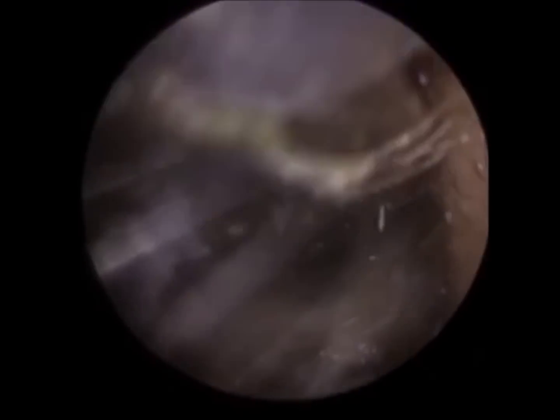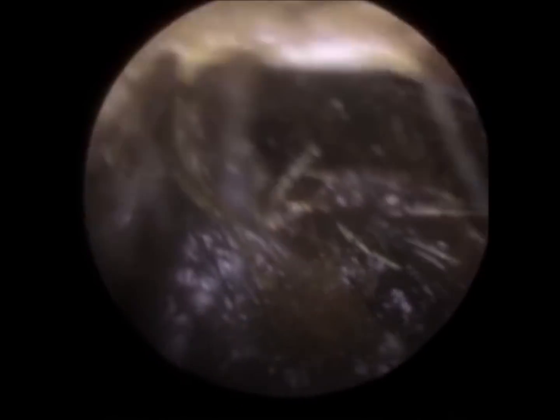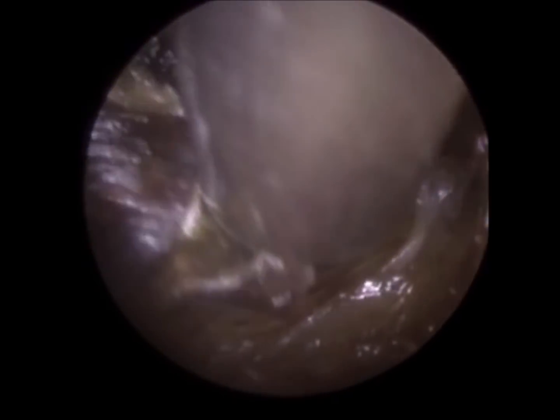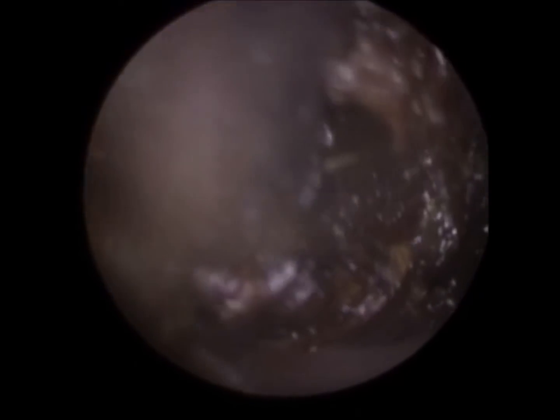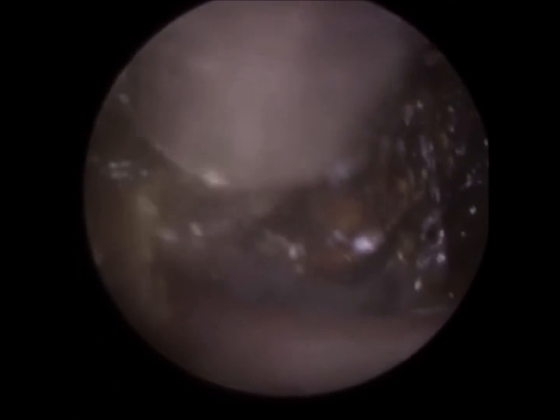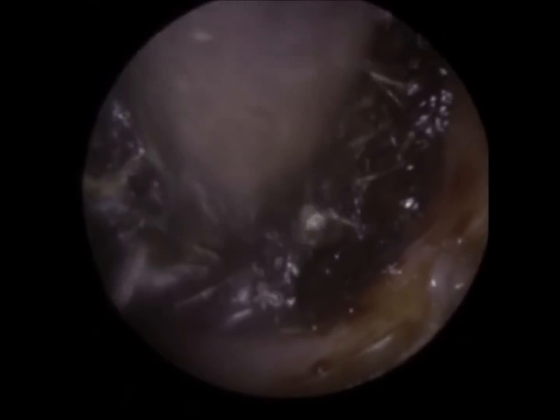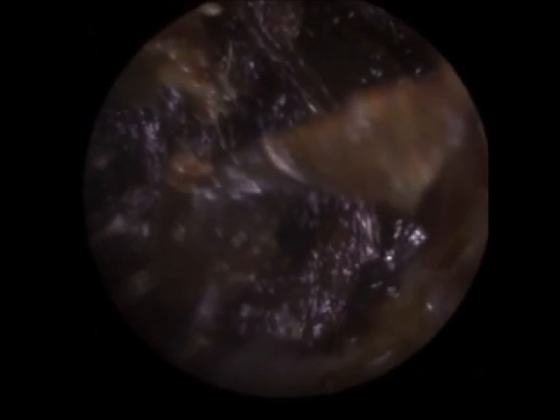But in this ear, after I moved the lateral wax, so the lateral means the wax near the entrance, the wax further in, so the more medial wax, is a lot more compressed. So I had to put some olive oil drops on a couple of occasions, just to loosen it, lubricate it, in order for me to remove. Again, I'm just targeting the rear, so the posterior canal wall there, just trying to loosen some of that dead keratin, and now at the base, and I'm just wriggling it, making little circular motions.